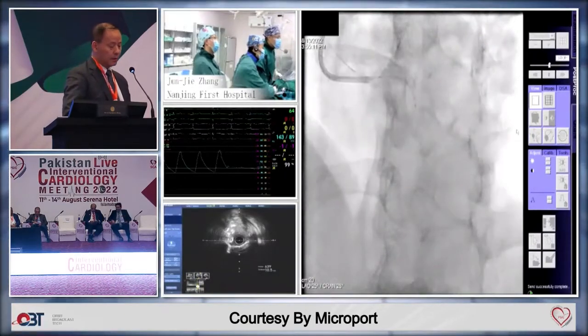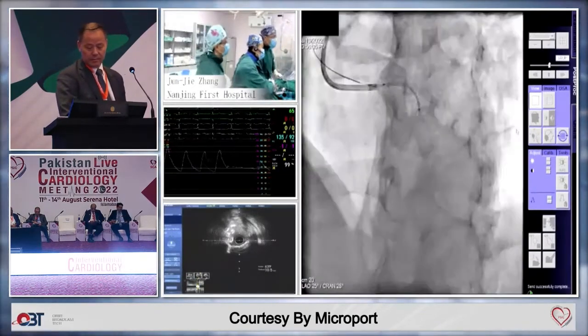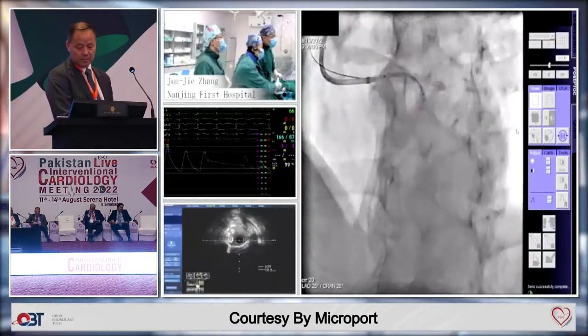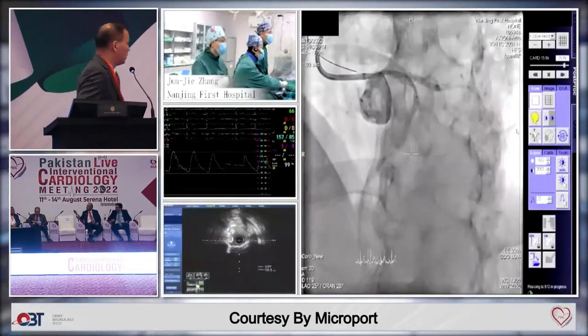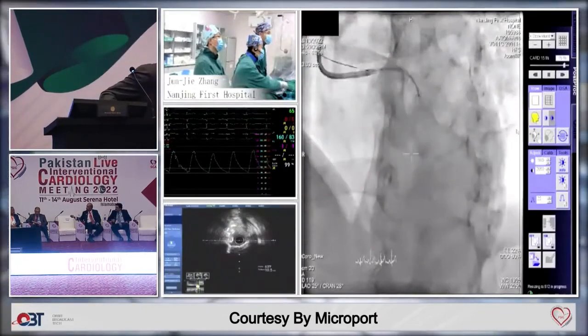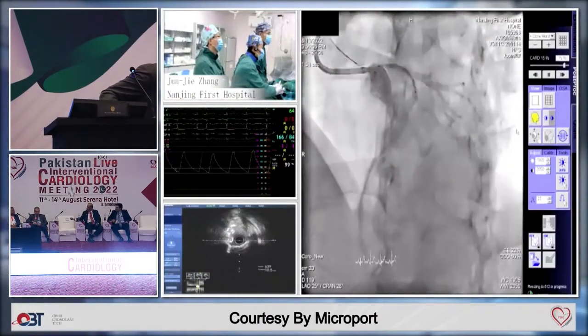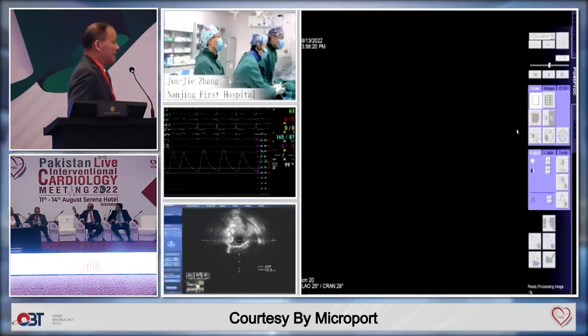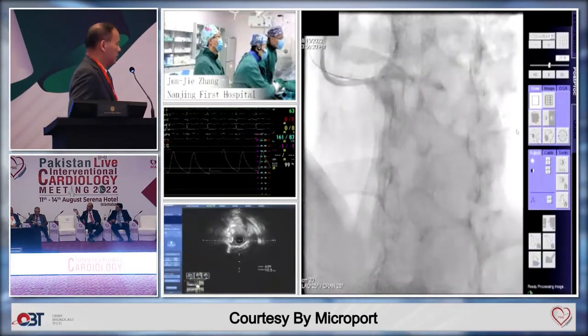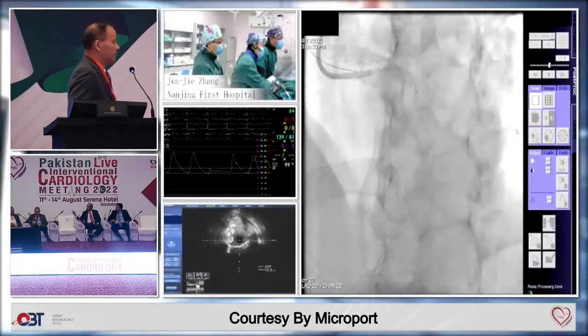Yes, please. I feel this is a good position. Are you happy? Whenever we are doing the left main, there's always this big debate: should you hang 1 millimeter out or should you not hang? Getting it right at the left main is always an ostial trick. So what is your take on it?